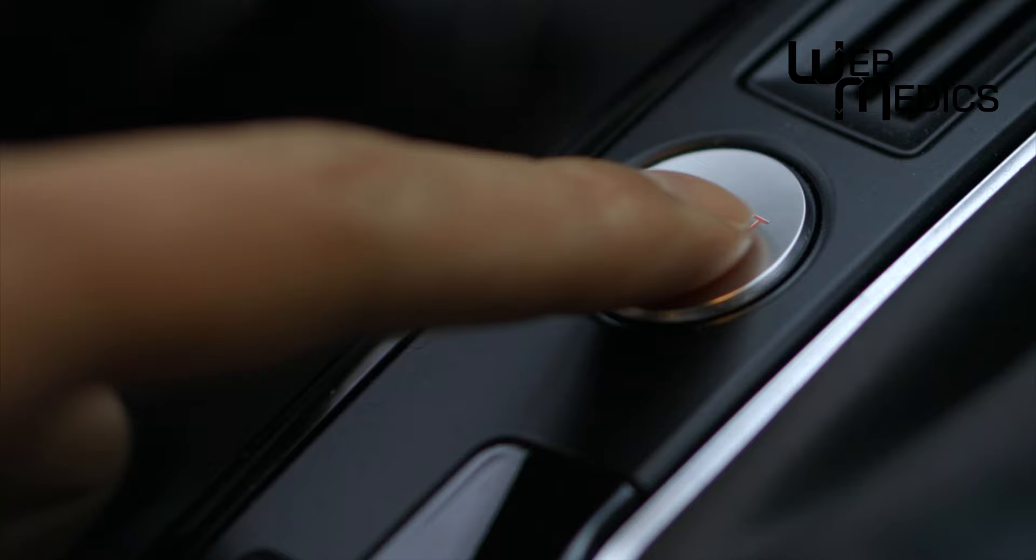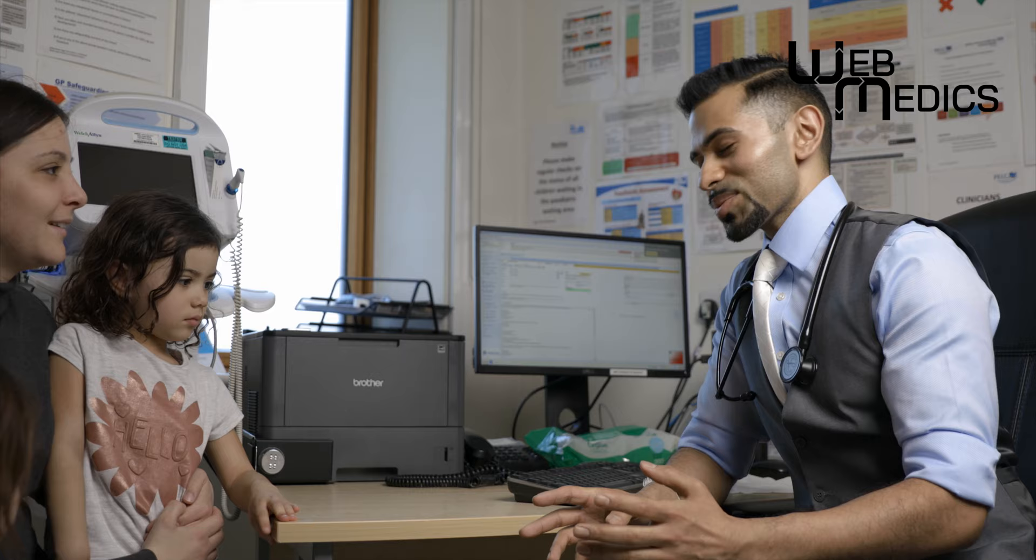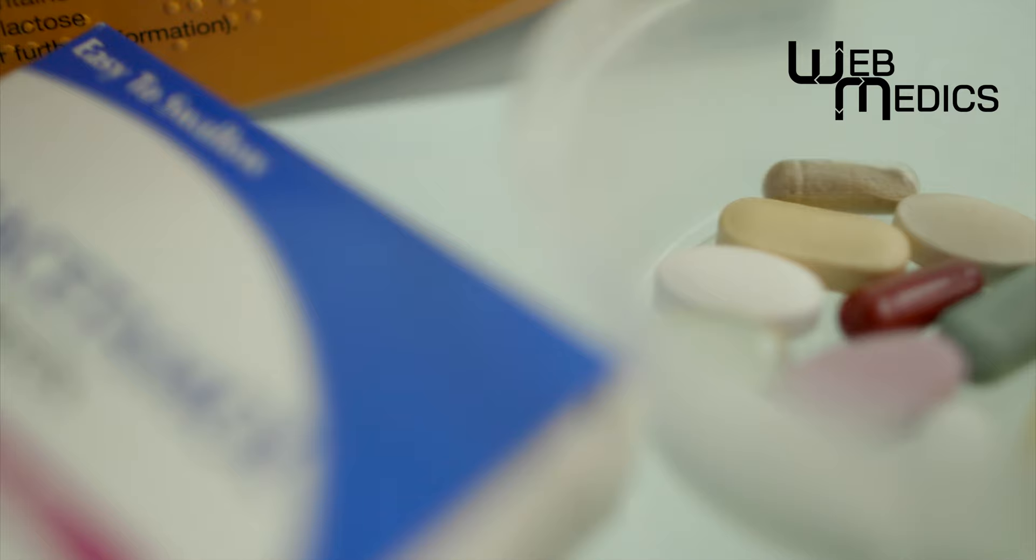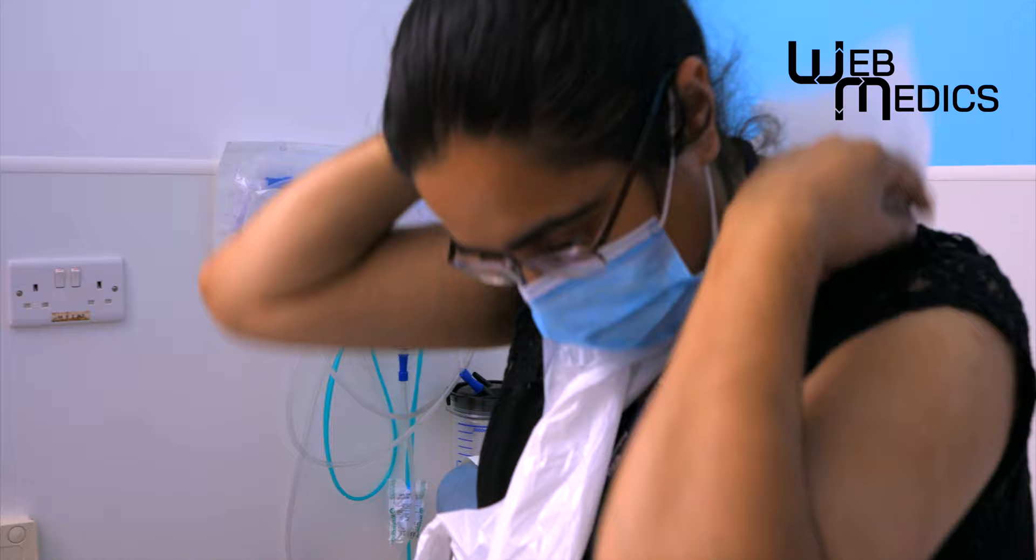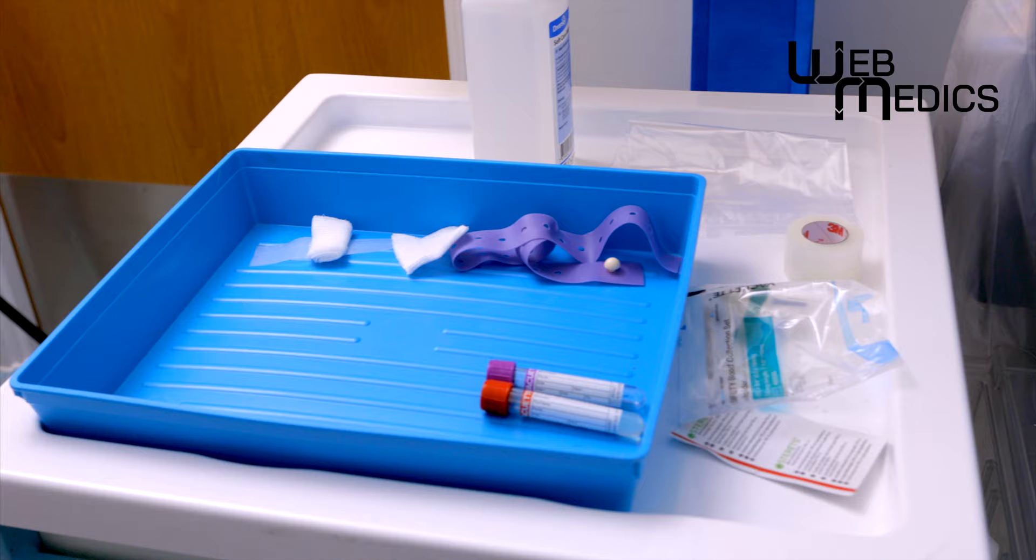But a bit like driving, some say I'm wasting your time trying to show you something that needs practice. They say I should just focus on the basics like establishing rapport, checking the ID, request form, and prerequisite fasting and medication. Having gained consent, washed our hands, donned our apron and gloves, cleaned our tray and trolley, checked our sharps bin, prepared the gear and gauze, we're ready to go, right? Or are we?